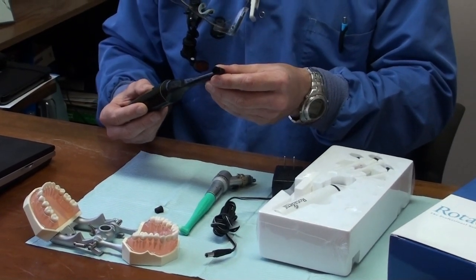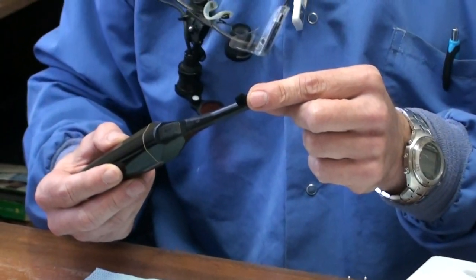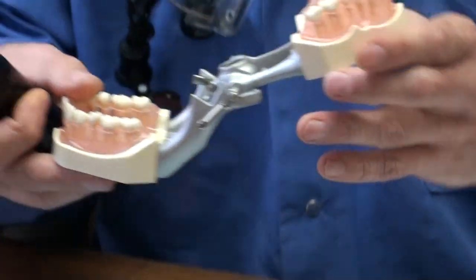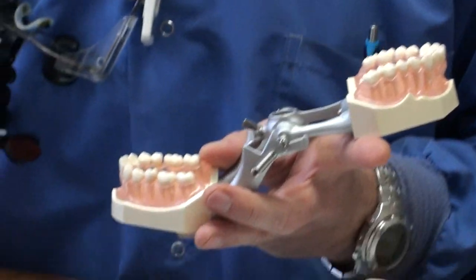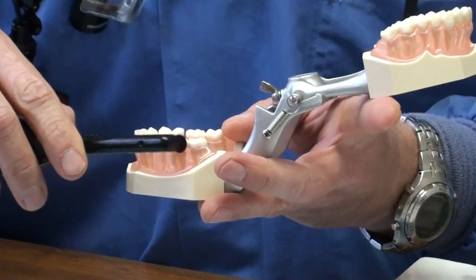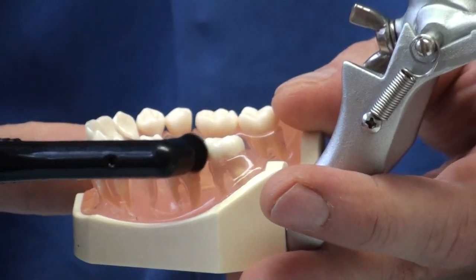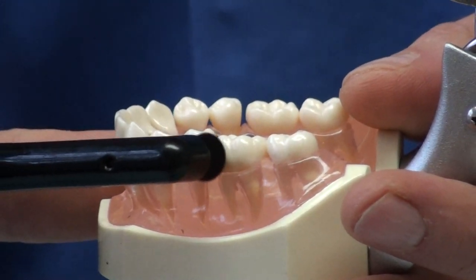There's a pointed bristle brush, which is this one here, and this is used for cleaning in between the teeth. On our model, you want to place it in between the teeth, turn it on — you can hear it going there — and use it for about three to five seconds for each tooth, in between each tooth.